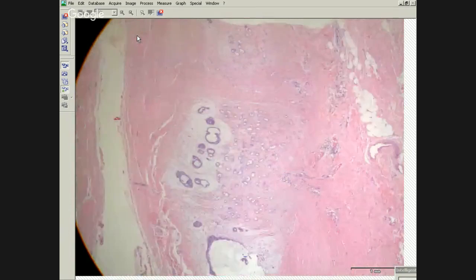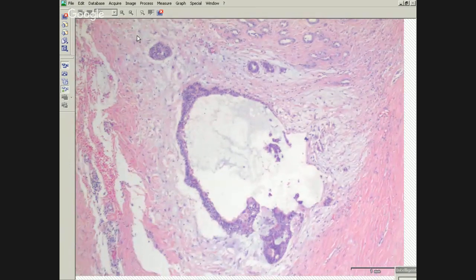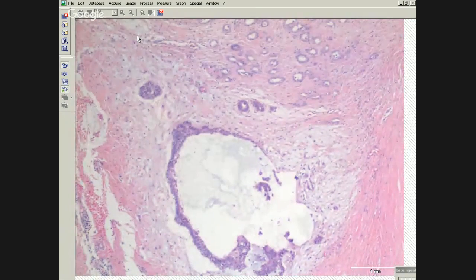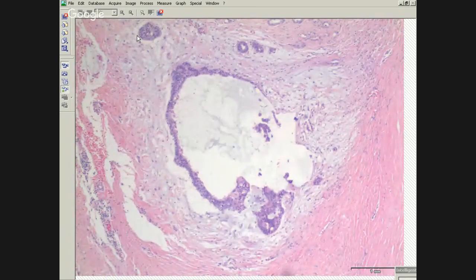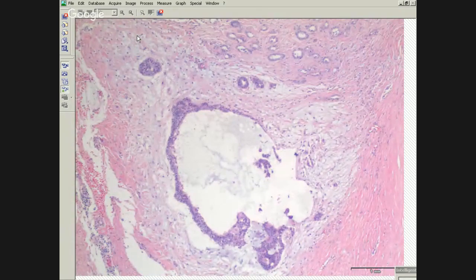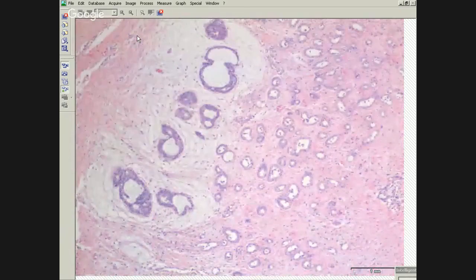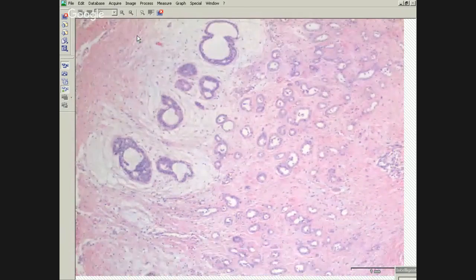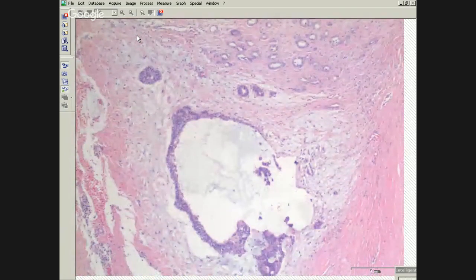are these areas here. So what do we think about this stuff? We have these glandular areas with mucin, there is extracellular mucin in some places. Okay, so you think that's mucin? Looks like mucin, I agree. And we have smaller glands too. Okay, so here we get to our first pitfall.